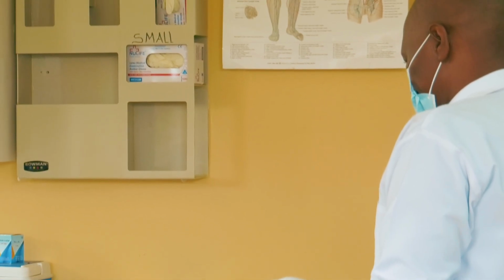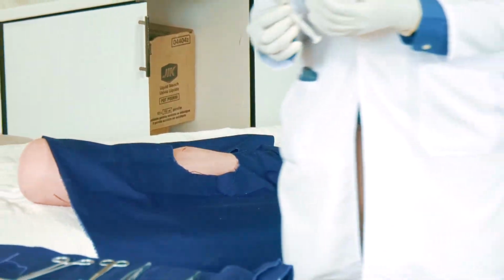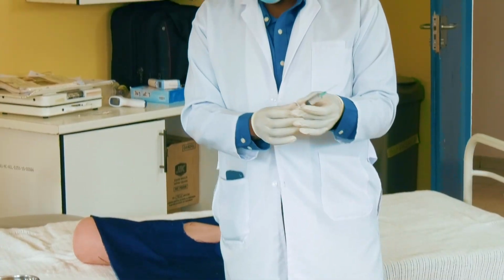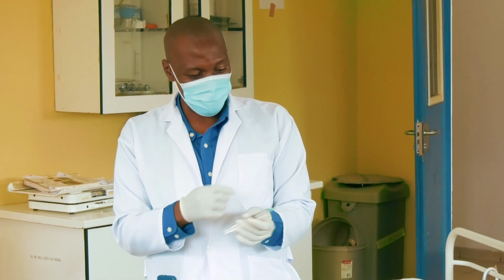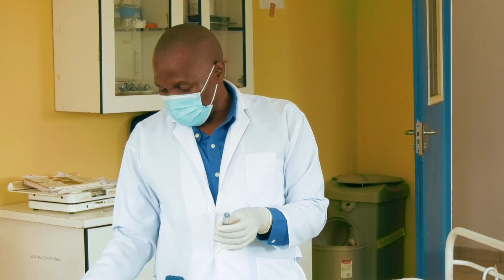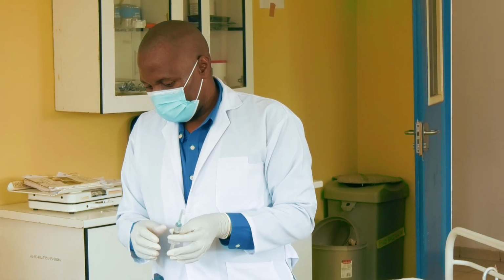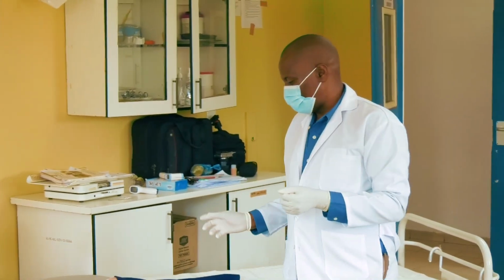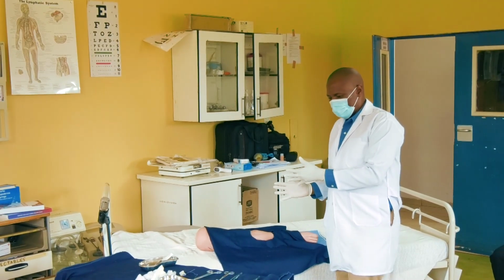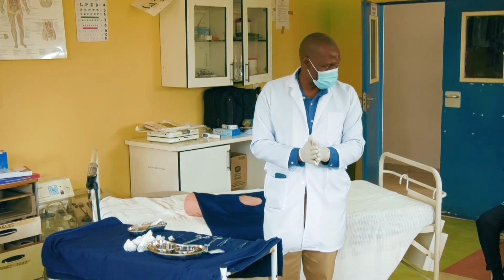There's one thing that I didn't do that we should just correct here, since other people will be learning from this. When I drew the drug using this needle, I don't have to use the same needle for local infiltration. So I removed it, and this is the needle I used. You saw that, right? Yes. Before the incident that we had. So you use another needle. So that we are done, then you start now your actual procedure that you are doing, simple suturing.